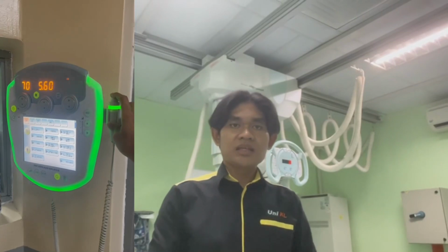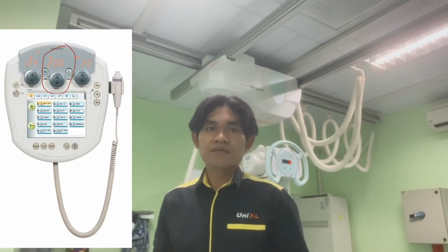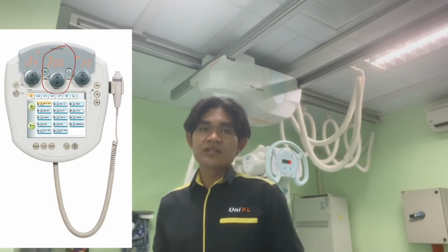Next is KVP adjustment. The icon is KVP with up down arrow. The function is adjust the kilovolt peak, controlling the X-ray beam penetration power. For MAS adjustment, the icon is MAS with up down arrow. The function is modify the milliampere second setting affecting the X-ray beam intensity.